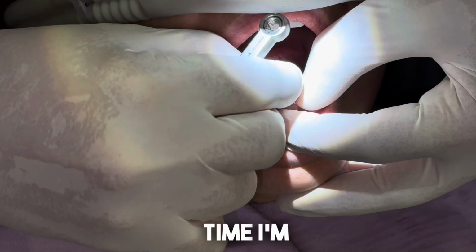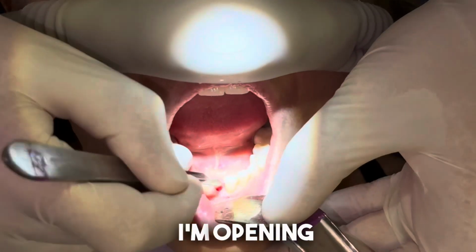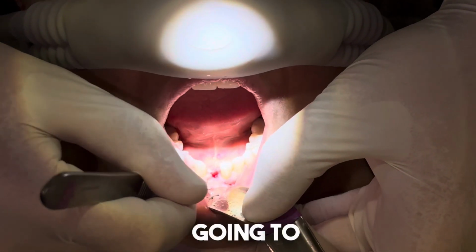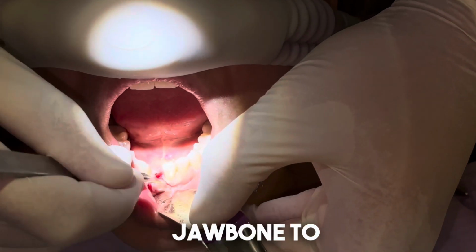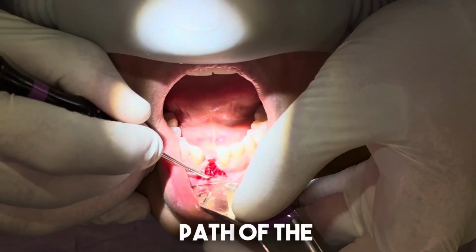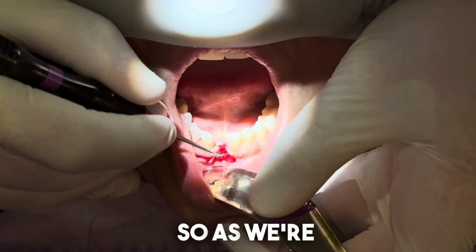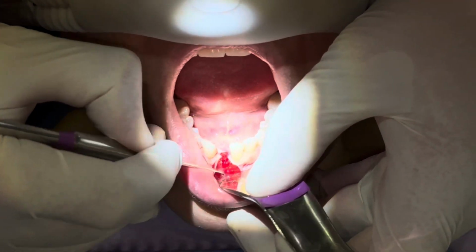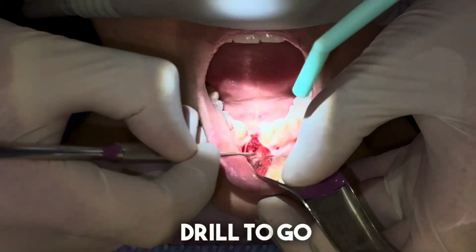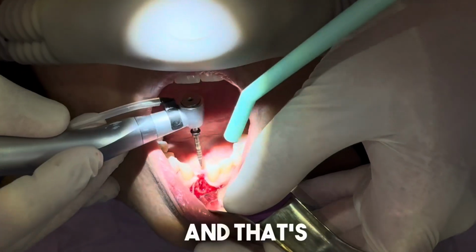And this time I'm going to open up the gums. That's what I'm doing right now. I'm opening up the gums, and we are going to expose the jawbone to make sure that we're seeing the path of the trajectory. So as we're doing that, we are going to allow for another drill to go in there, but now we're visualizing where the bone is, and that's what I'm doing right now.